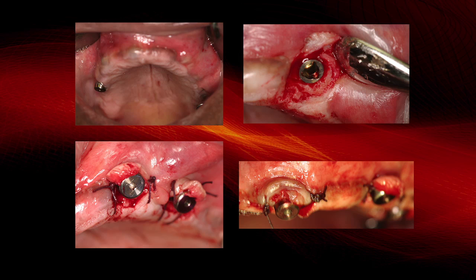So in order to do that, again, we're going to make our incision to the palatal side of the crest and bring the keratinized tissue to the labial, as you can see here. So this helps reduce the need for connective tissue graft. So it's simpler. It's very simple. And, you know, the tissue is like water. How it heals, it seeks its own level. So here it'll be nice and blended. And maybe the next time we meet, we'll be able to show you this case that's finished.